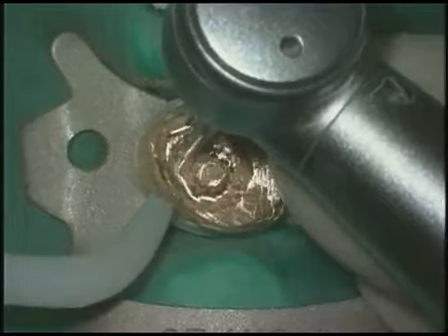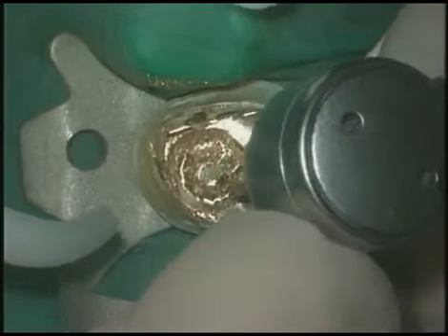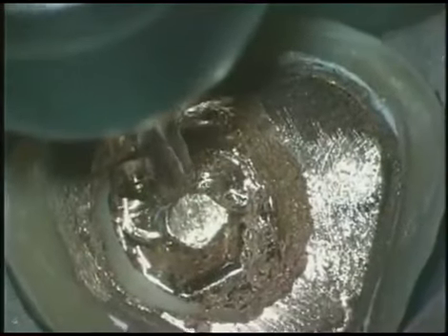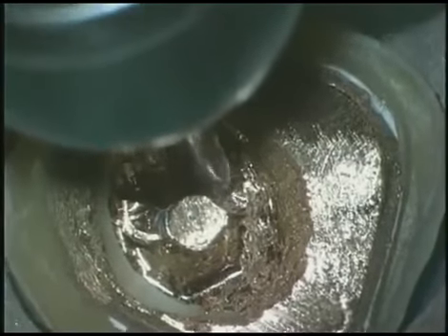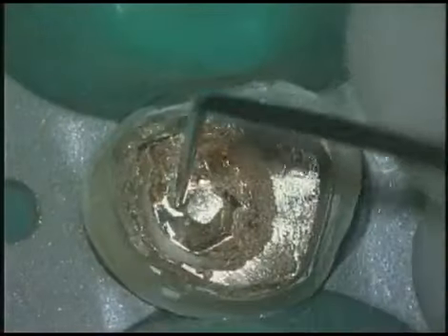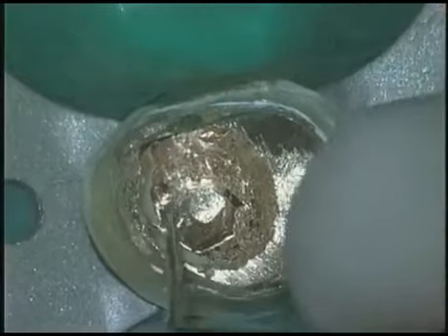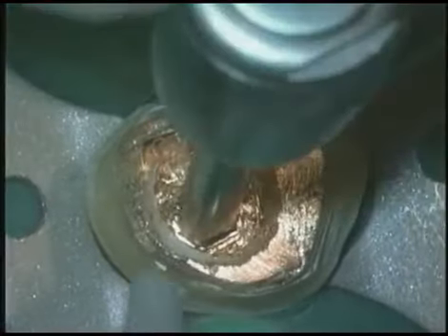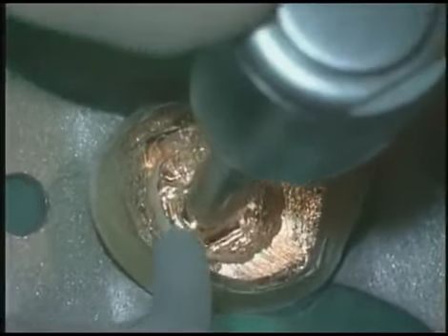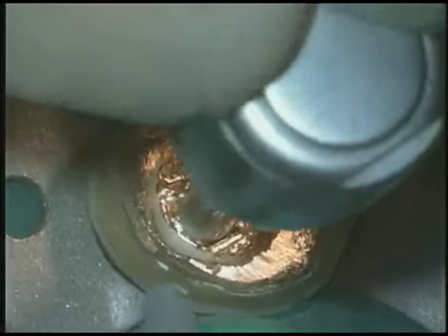By removing the core down 2 or 3 millimeters, we begin to expose the post, but frequently there'll be a very thin onion skin layer of core still present around the actual post. This is seen here with an Explorer. Don't really waste a lot of clinical time here because we can immediately go to a trephine, and going from big to small, we can reduce that post and throw off all the residual core that was around the post.